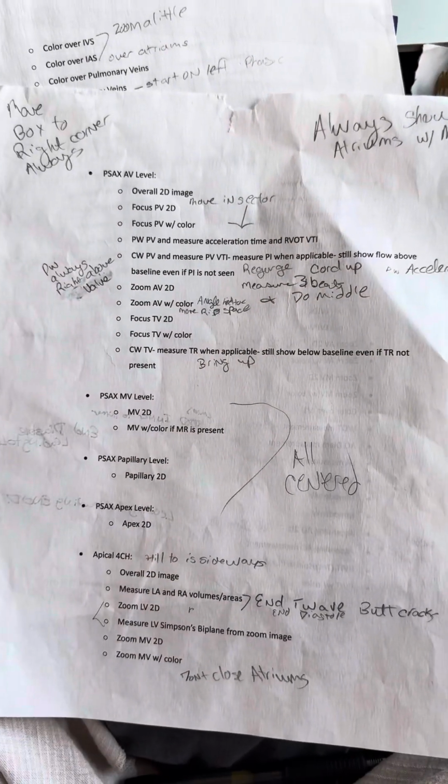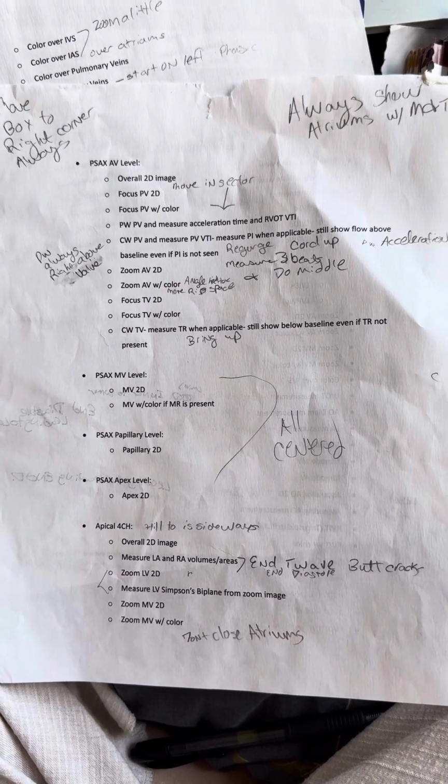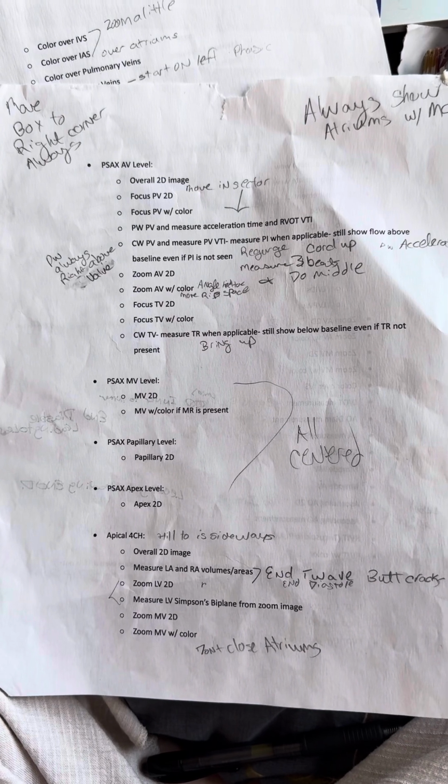Now we start the P-sacs. You want your overall AV level image. And then you move to focus your pulmonary valve. Focus the PV with color.